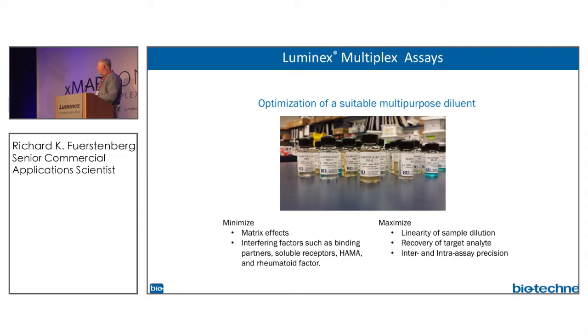So we spend a lot of time developing these diluents and making sure the assays work in the end. We can't say exactly what's in those diluents. They're kind of trade secrets, but suffice it to say that our most recent assay probably took about 14 to 16 months for us to develop and make sure that it hit all of our specifications.